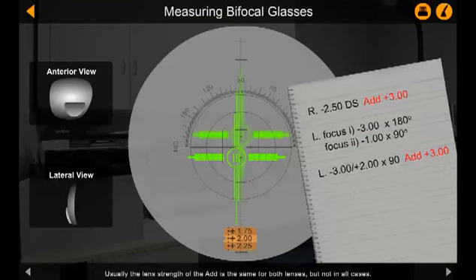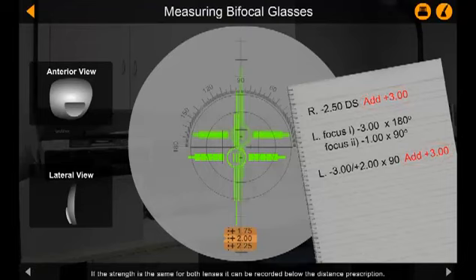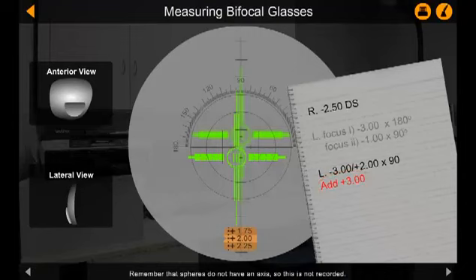Usually the lens strength of the add is the same for both lenses, but not in all cases. Regardless of the type of lens, if the strength of the add is different for each eye lens, it needs to be recorded next to each lens prescription. If the strength is the same for both lenses, it can be recorded below the distance prescription. Remember that spheres do not have an axis, so this is not recorded.